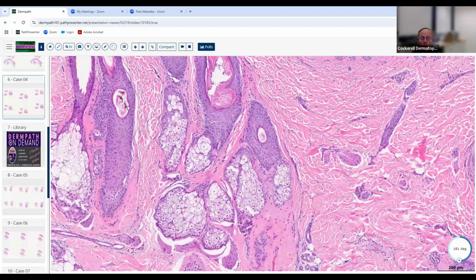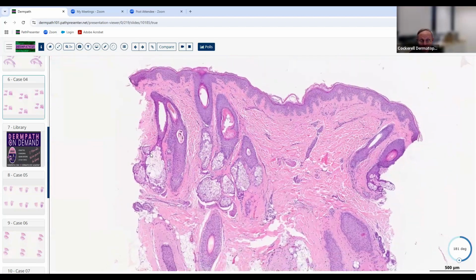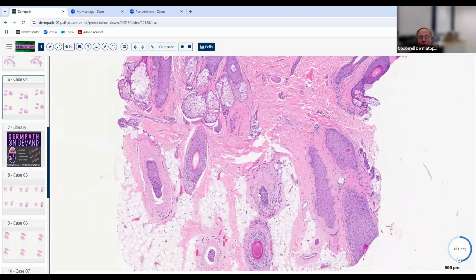And they're nervous about it. Maybe they're nervous, and that causes the alopecia areata to begin with. And then they just compound the problem by inducing secondary changes here. So that could be what's going on here, because this has got a little bit too much in the way of sebaceous glands, just for garden variety trichotillomania.